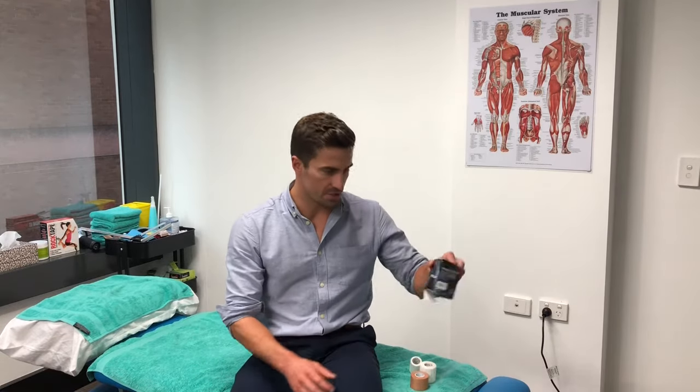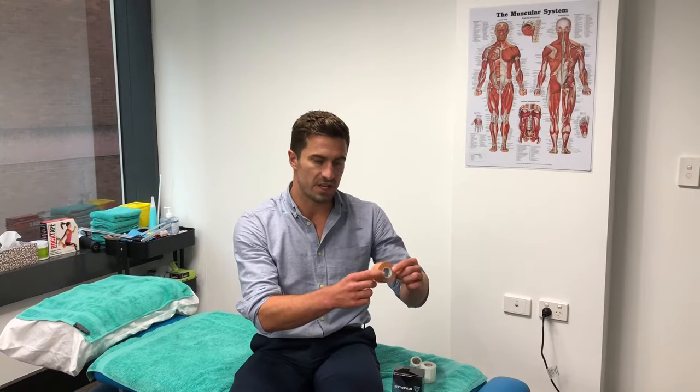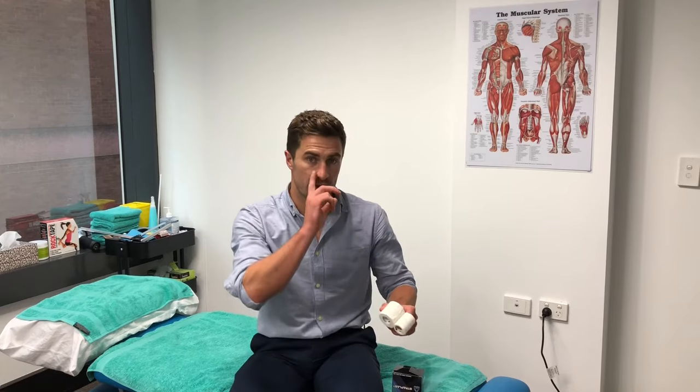The type of tape we're going to be using today is first of all this Straplast, which is just like an under wrap. It's just a bit easier on the skin — you don't need to use too much of it, but just to form your anchors we'll be using that today. The majority of our taping will be coming from this rigid tape, which is just a 38mm rigid tape. And this one you can use — you don't have to — but we're going to be using it today, which is just like an over wrap, just to prevent the tape from falling off if you are doing some sort of high impact sport.